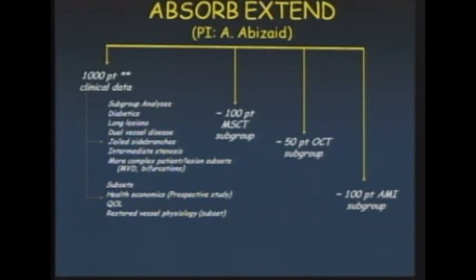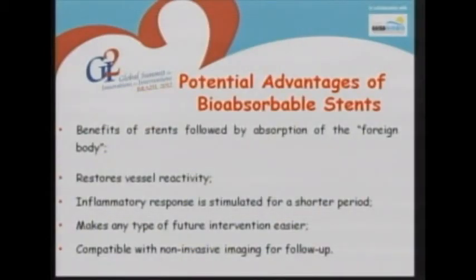I think this also fulfills the expectations of Dr. Leon, who was expecting us to treat a longer segment from normal to normal. As potential benefits and advantages, Dr. Serraz has talked to us a lot about this new frontier. It restores vessel reactivity.